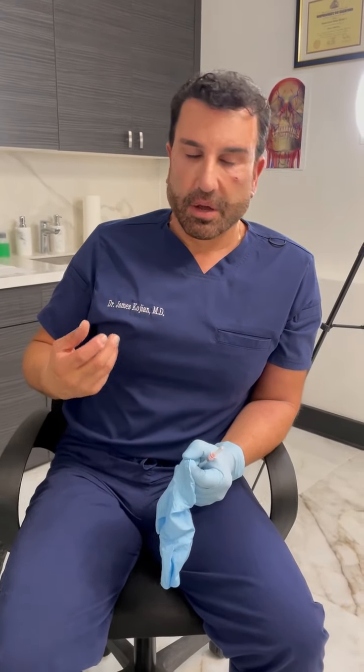So this is cheek augmentation using filler. The product I like to use for cheek augmentation is Radiesse. Number one, that's my favorite. You get 1.5 milliliters of calcium hydroxyapatite. The other fillers that are good also are any of the Juvederms, the Restylane family like Lyft, that's fine also. Voluma, of course, is very good because that lasts almost 2 years. Things you don't want to use are the really fine fillers that only last a few months, and there's a bunch of those out there.